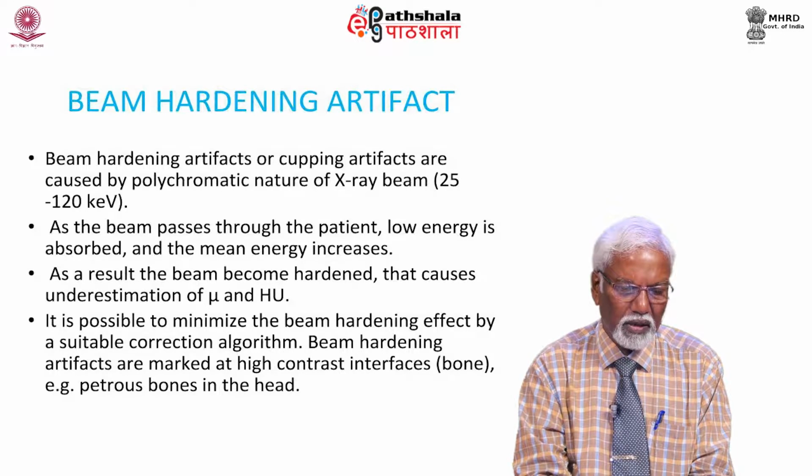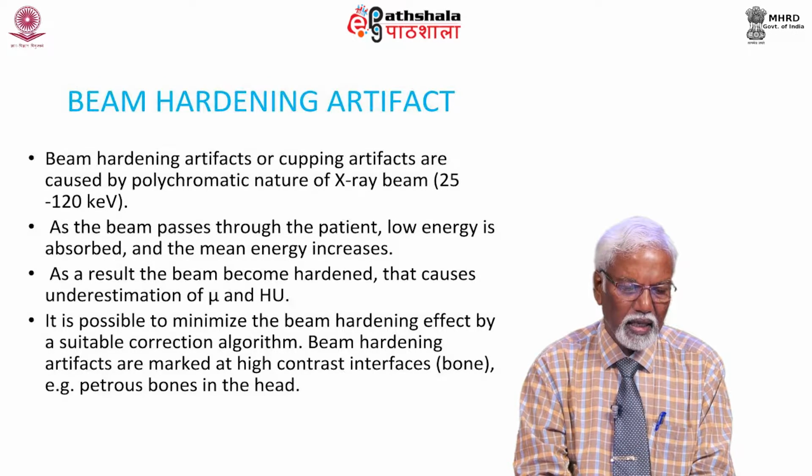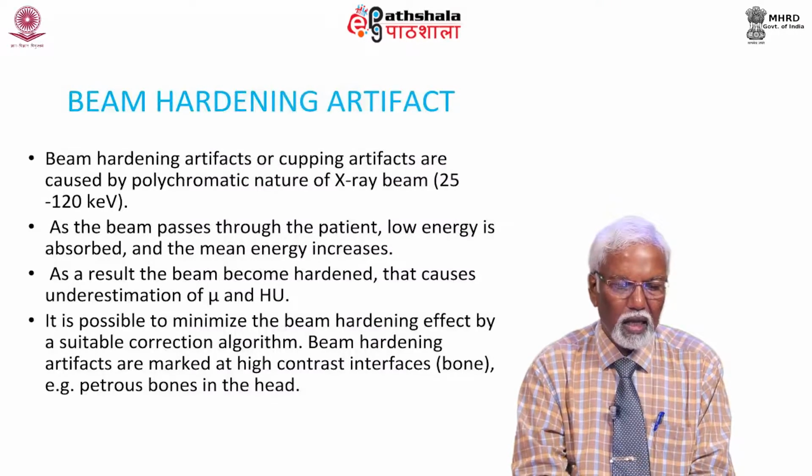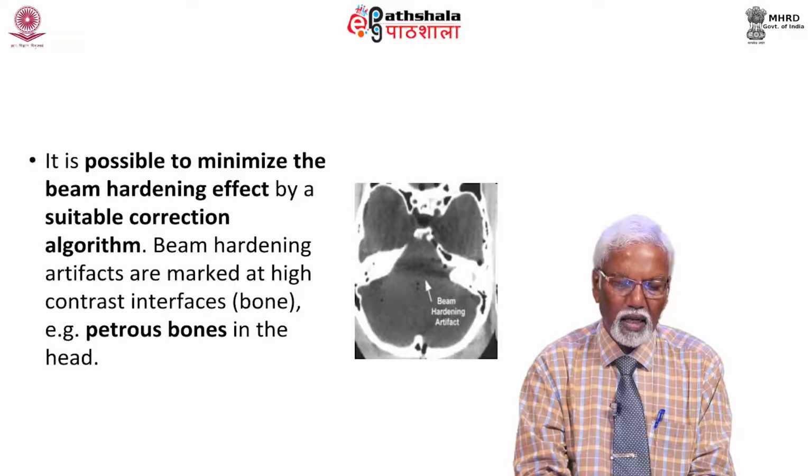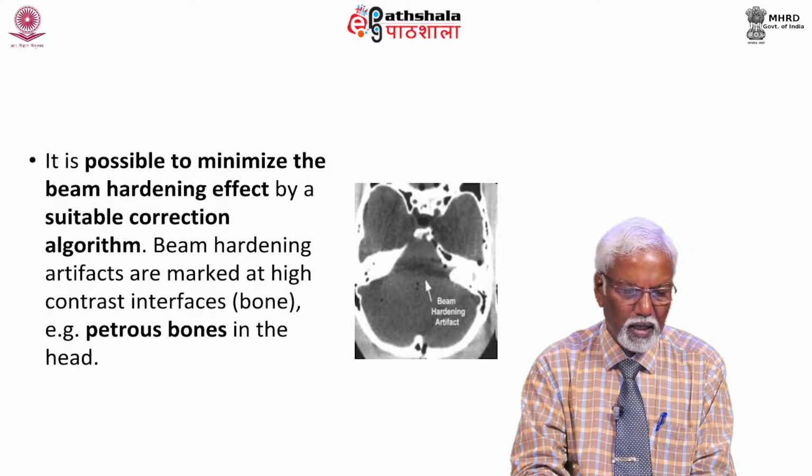Beam hardening artifact is marked at high contrast interfaces, for example petrous bones in the head. You can see it in the right side picture near the arrow.